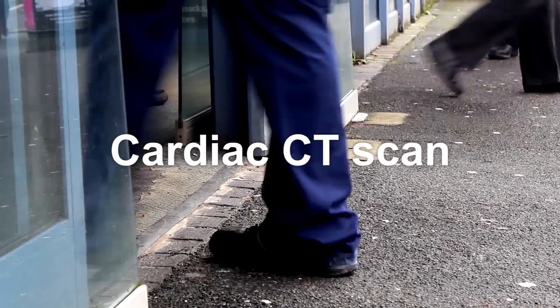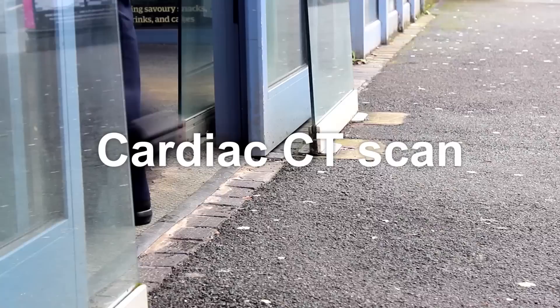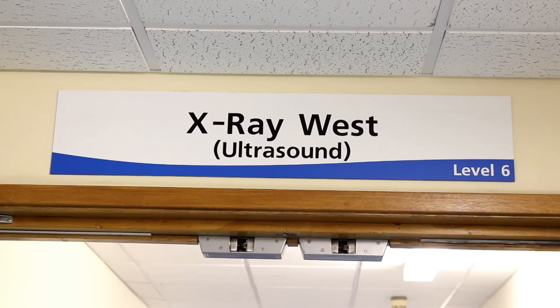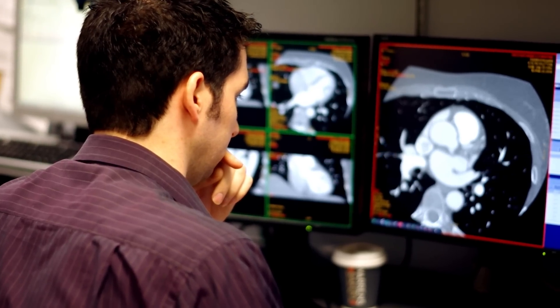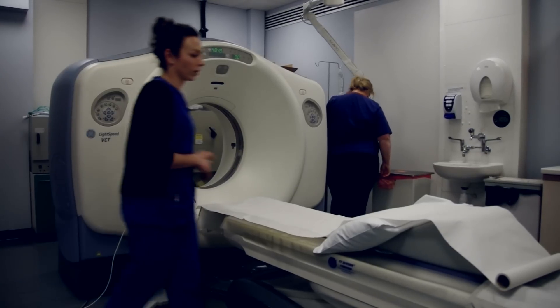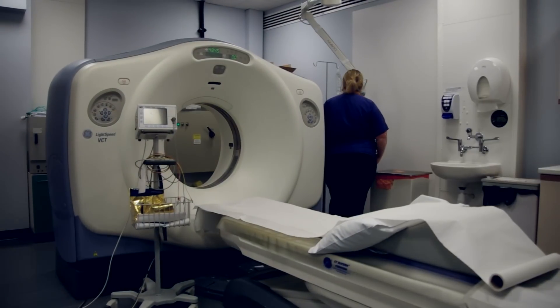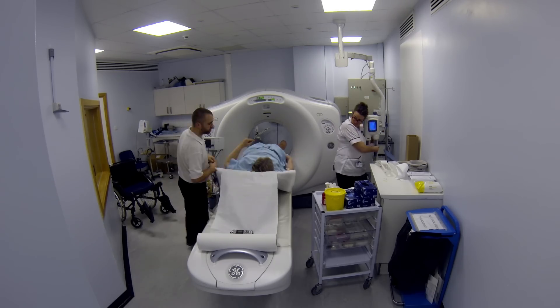You're going to have a cardiac CT scan. This film will explain what the scan will involve and allow you to prepare for the test. CT scanning uses x-rays. The team at Derriford are some of the most experienced in the world and we have a very good record of keeping our x-ray levels to a minimum. The overall risk from this test is therefore low. The scan itself is painless and it's pretty quick, lasting just a few seconds.